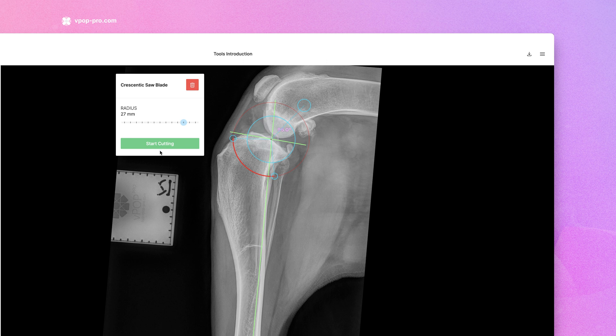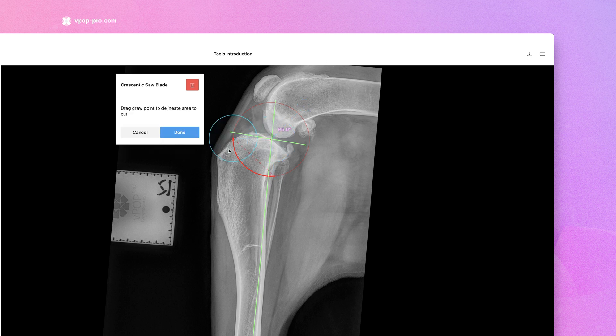When ready, start your cut. Now, delineate the fragment you wish to move.